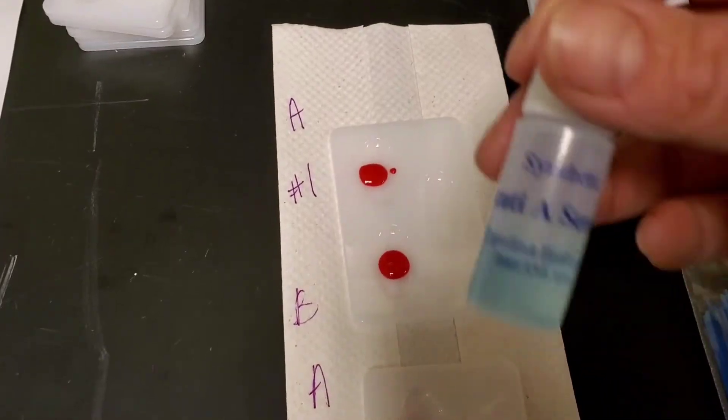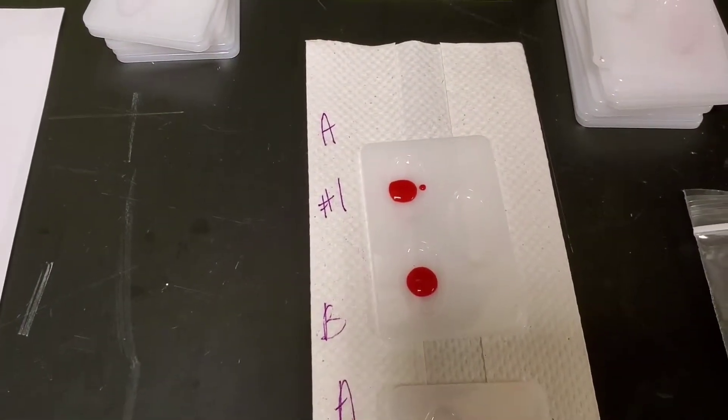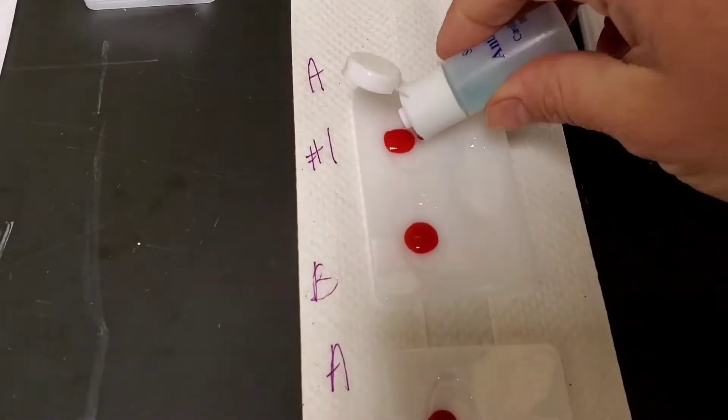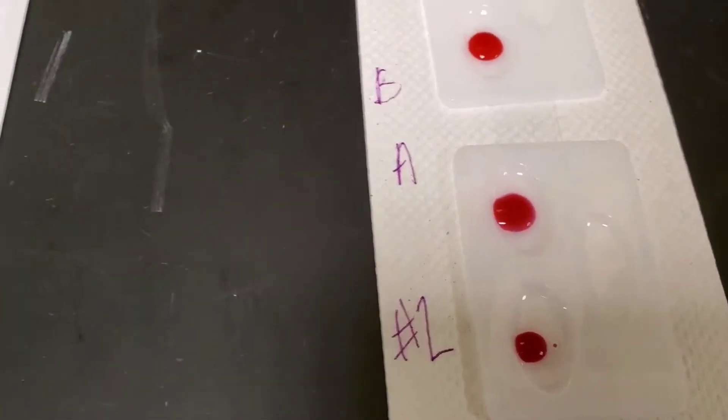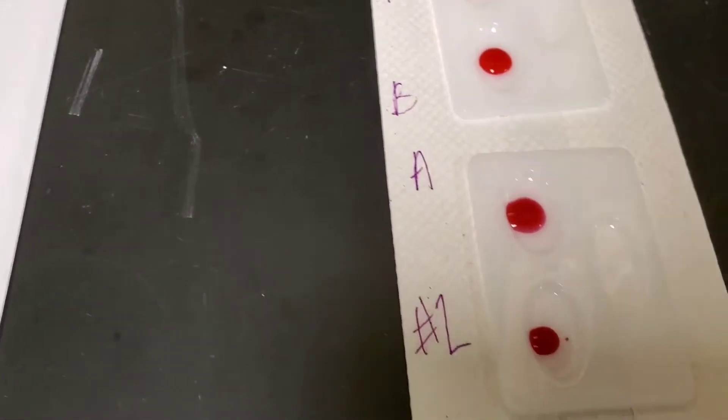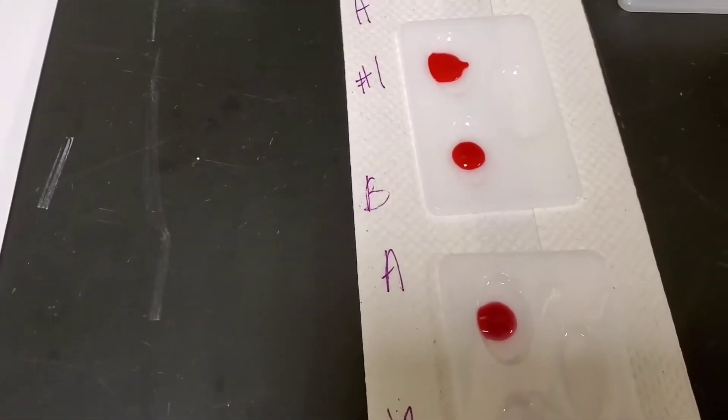Now I'm going to take the anti-A serum and put it in the A plates for both patient one and patient two. And now I'm going to do the same thing with the B serum in well B for patient one and in well B for patient two.